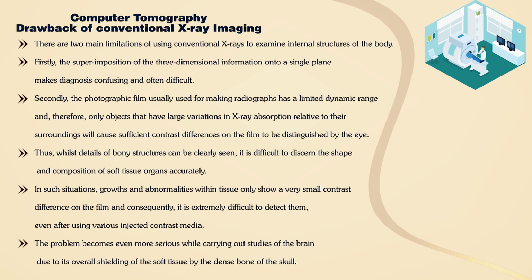Thus, whilst details of bony structures can be clearly seen, it is difficult to discern the shape and composition of soft tissue organs accurately in conventional X-ray imaging.